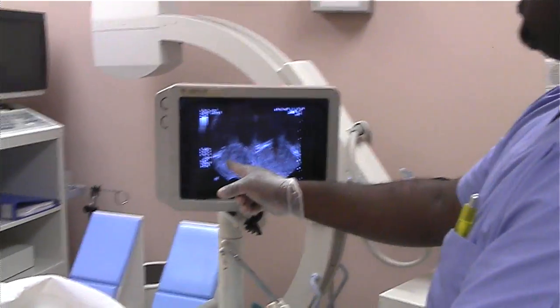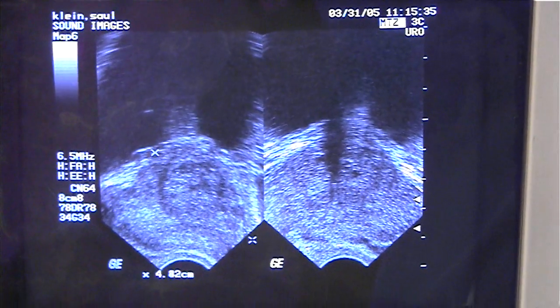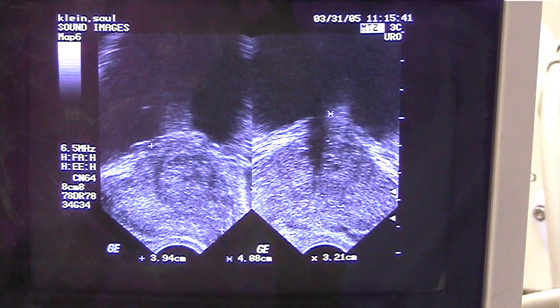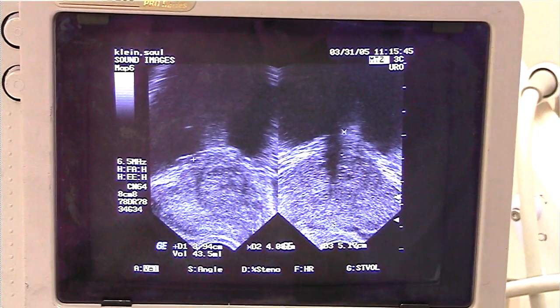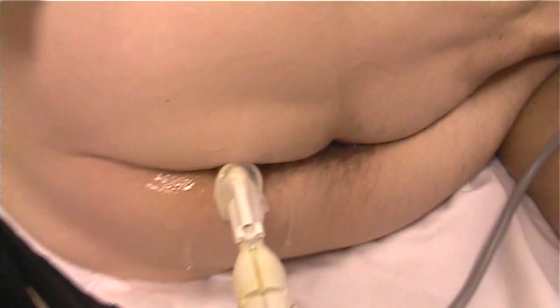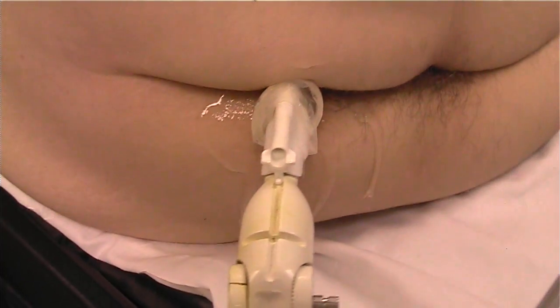We've got the sagittal and transverse for a height, width, and length measurement that gives us a volume, and the computer calculates that number for us — a volume of 43.5. Once again sagittal view and transverse. And that's the actual needle guide and probe.